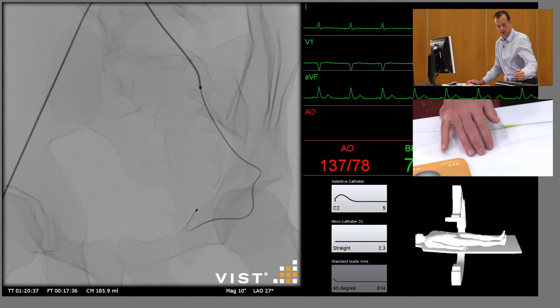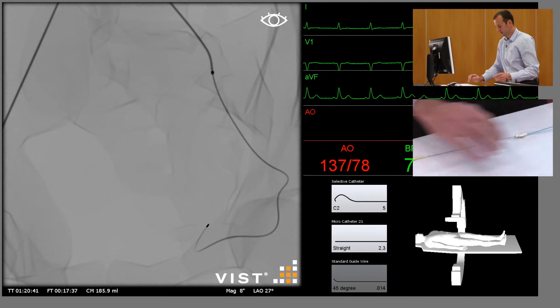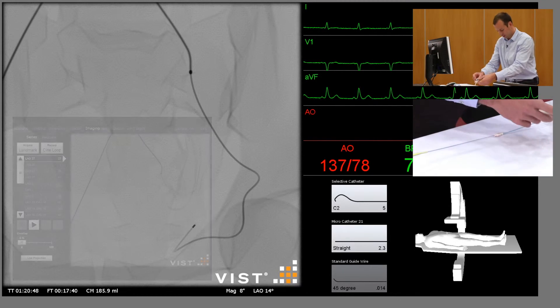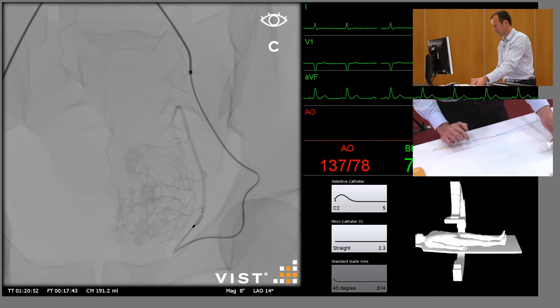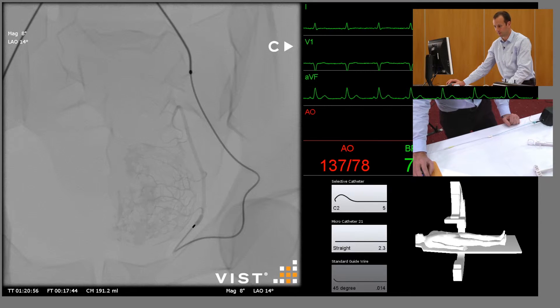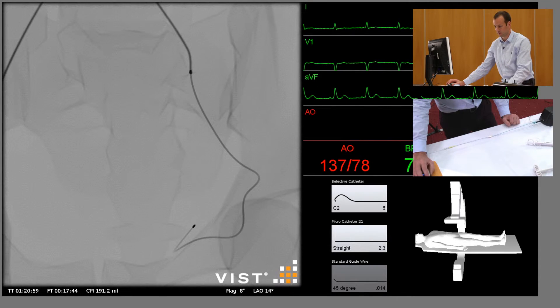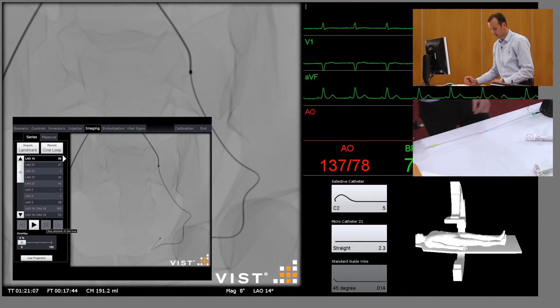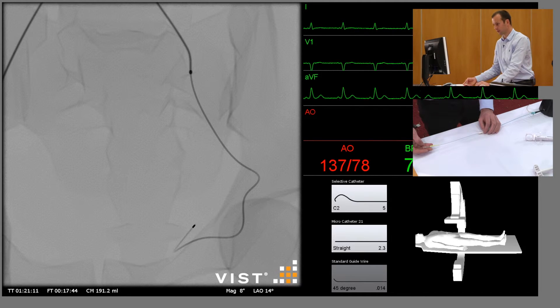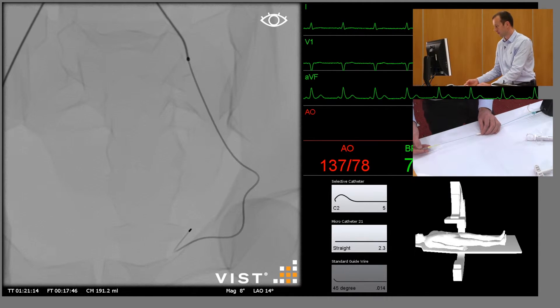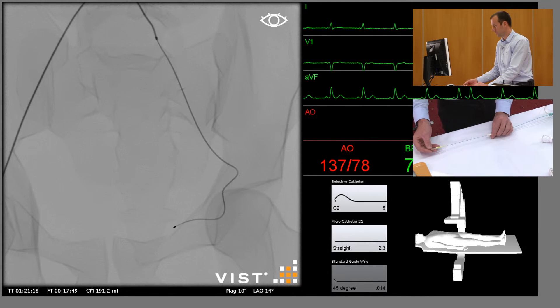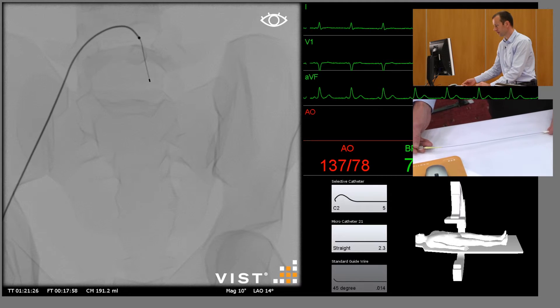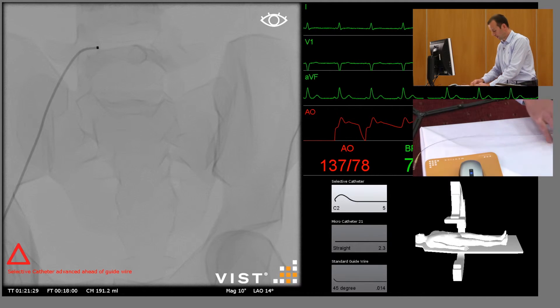Remove the guide wire. We'll just mag up once — I think we'll straighten the C-arm and perform an angiogram. Now you can see good opacification of the fibroid. So now we've performed the angiogram of the left uterine artery, we're going to come back, come off magnification, centre north, and do the same thing on the right hand side.